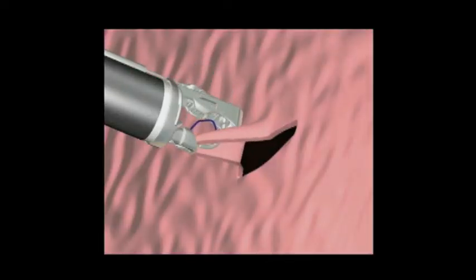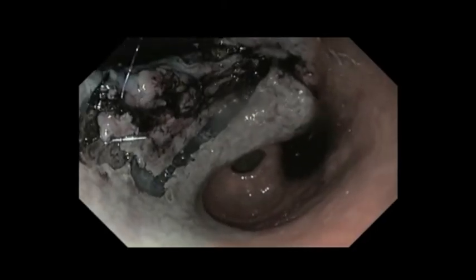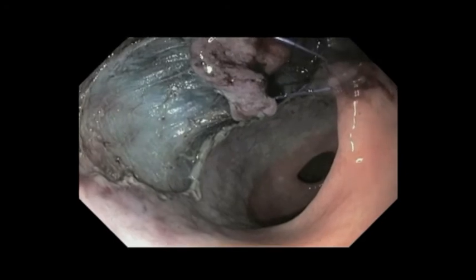The suture is passed with a dual-channel endoscope after the tissue is grabbed, so you can get a good purchase. This is the first bite on the greater curve. We're testing to make sure we've got a good bite, then grab the leading edge of the lesion and take another bite there. You leave the anchor off and you can see some retraction as we test our system. We did this two more times — a total of three retraction sutures were placed — and you can see it lift off the underlying muscle quite nicely.